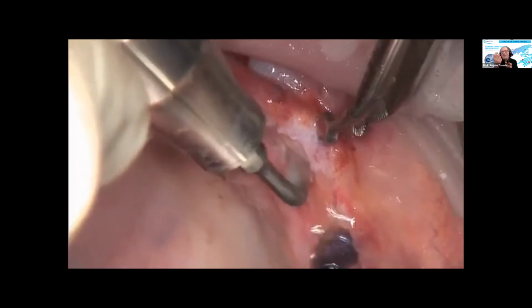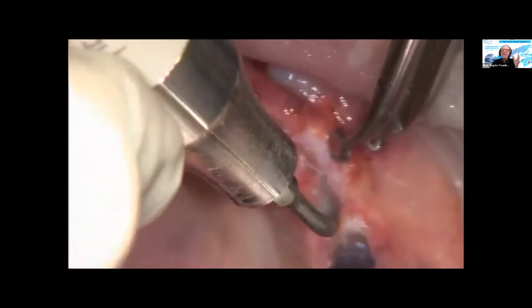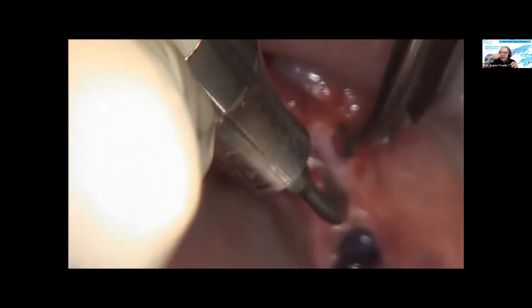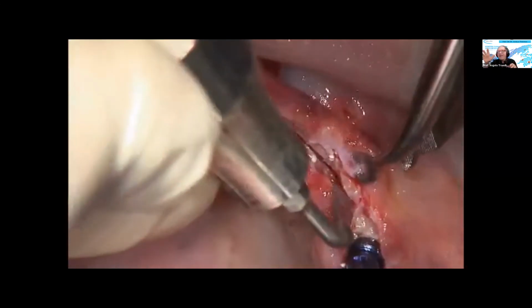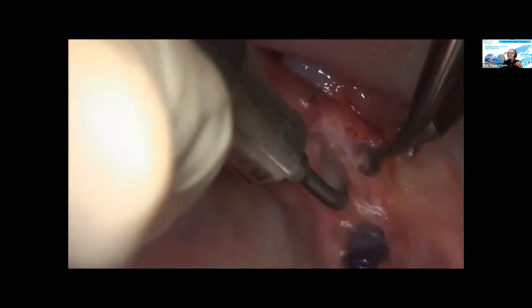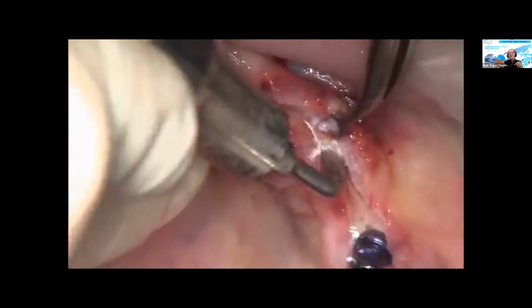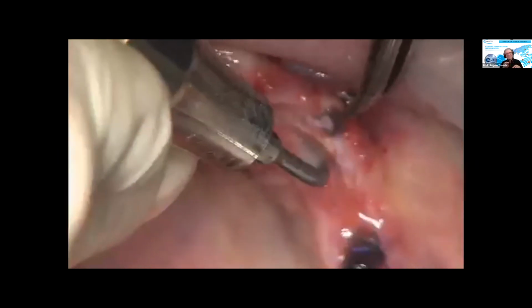And once again, you see there is almost no bleeding, there is sound, there is no stress because you don't need much hand force. Of course, it might make you feel bored. It's completely different if you have to tame a rotary instrument that wants to go to paths that you do not want it to go to, or if you simply hold the instrument in your hand without much force and you go bzzz, the typical sound of the piezotome.